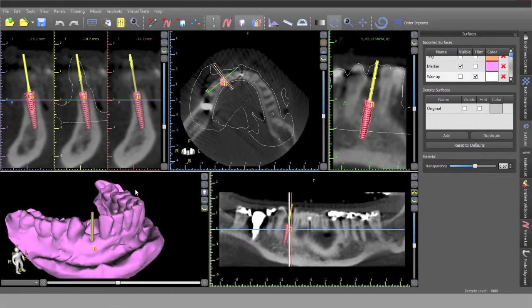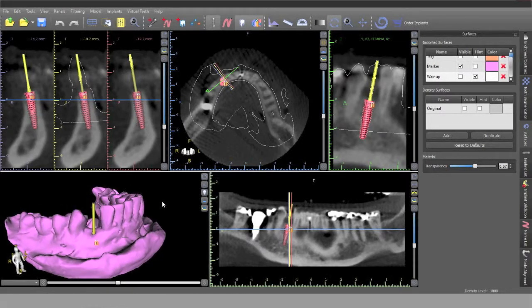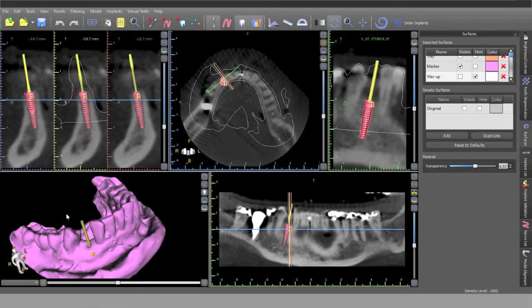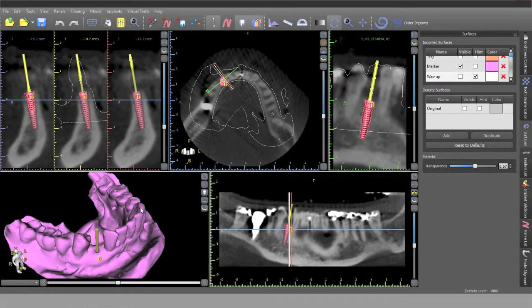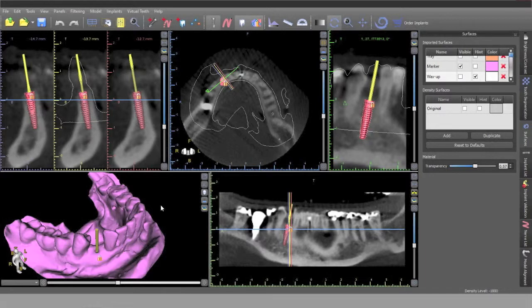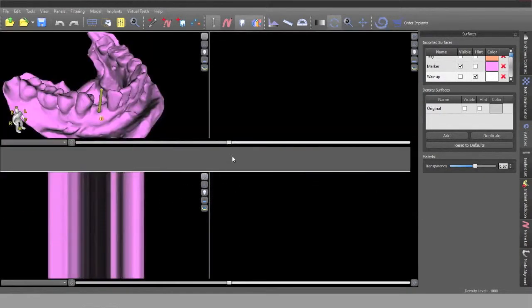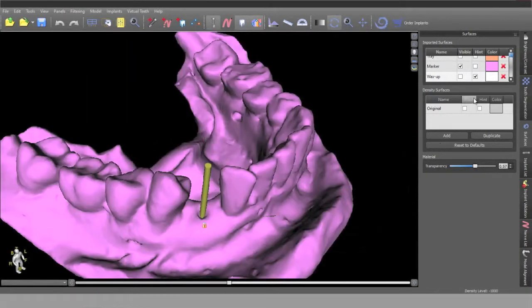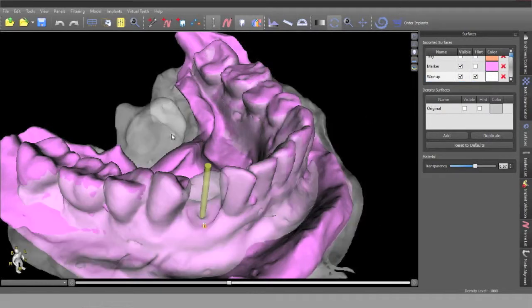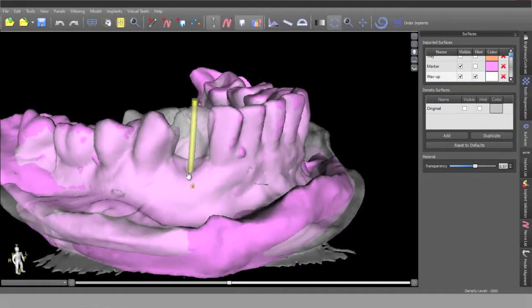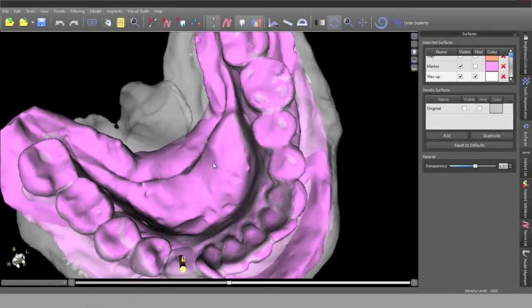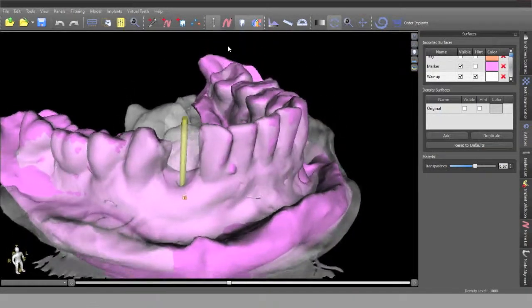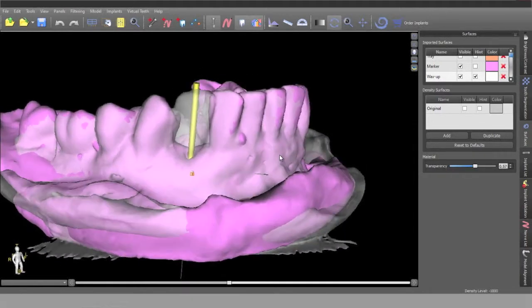So it's really what I'm interested in illustrating here is the paradigm that, although we say that a lot of our methodology allows one to plan these cases without wax-ups, in some cases it's prudent to do a wax-up. And this is a case like that. And the way it was planned was by initially placing the implant through the wax-up tooth so you can see exactly how it will be in the future tooth, and then working backwards to the bone and seeing how close you could come to that optimal position.